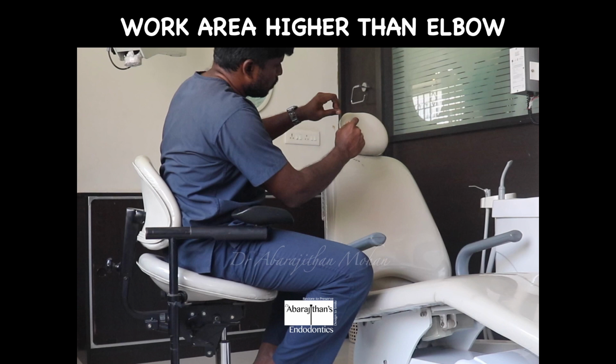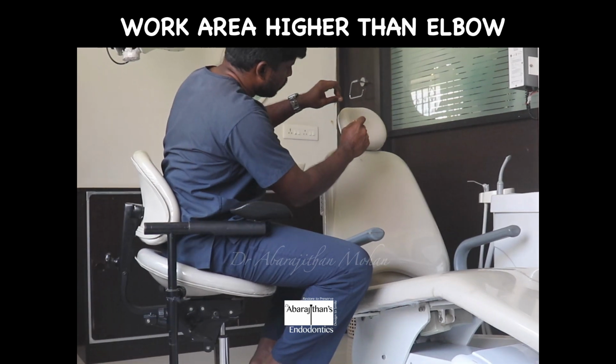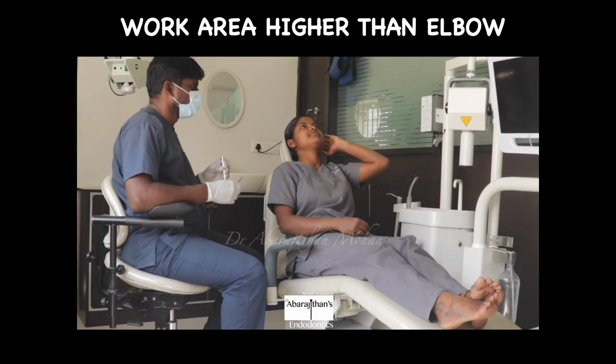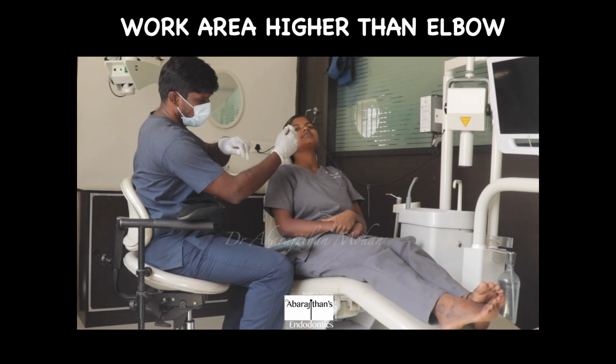So you can see here, in spite of adjusting the operator's stool ideally, if the work area is not in the ideal position, that is if the patient's head or the patient's mouth is not in ideal position, again you're going to have a problem. This is one of the common mistakes that people make. They keep the dental chair high. When you select dental chairs, most of them look cozy when you buy them, but how you actually select a dental chair is to choose one that can really go low in height.